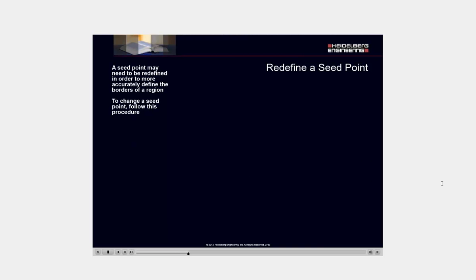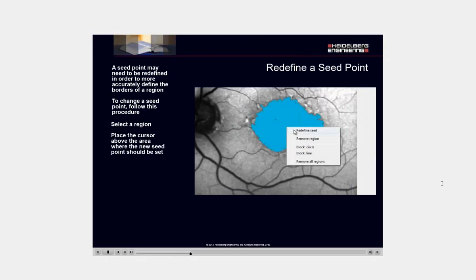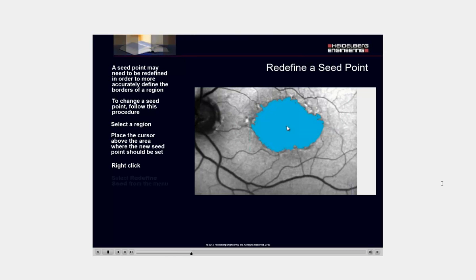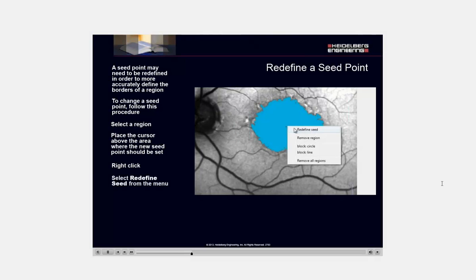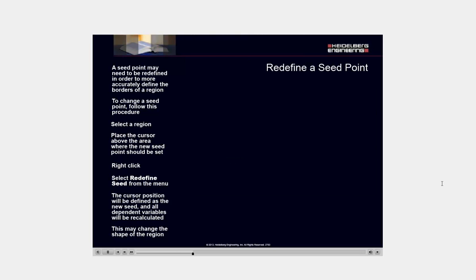A seed point may need to be redefined in order to more accurately define the borders of a region. To change a seed point, follow this procedure. Select a region. Place the cursor above the area where the new seed point should be set. Right-click. Select Redefine Seed from the menu. The cursor position will be defined as a new seed, and all dependent variables will be recalculated. This may change the shape of the region.